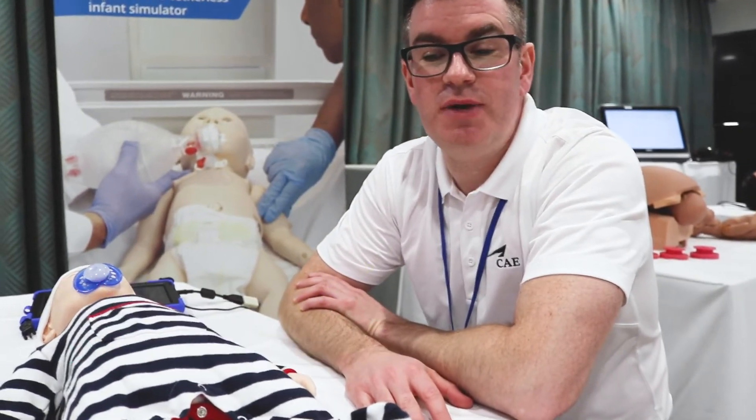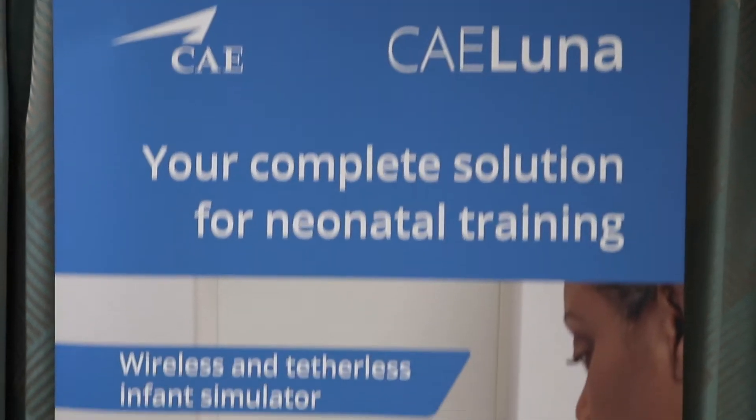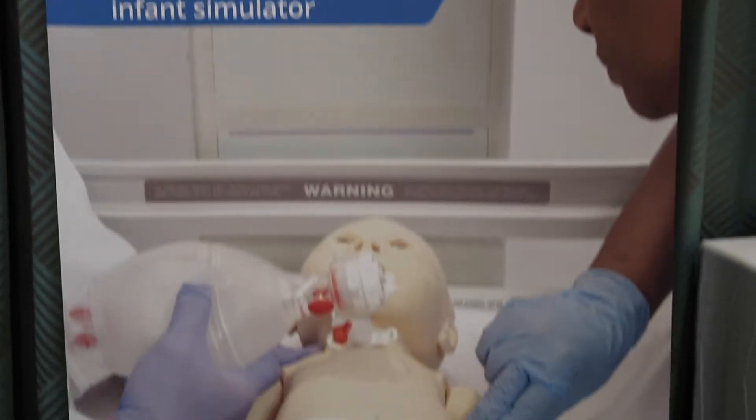Hi, my name is Kieran Feeney from CAE and we are currently at UK HBSN in Nottingham. I'm just going to spend a few minutes talking about our new newborn simulator, CAE Luna.